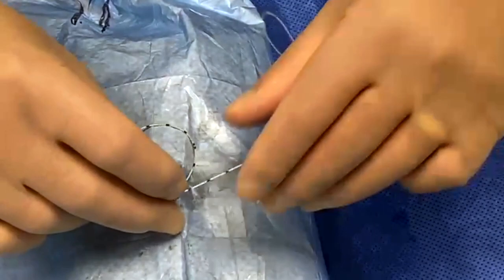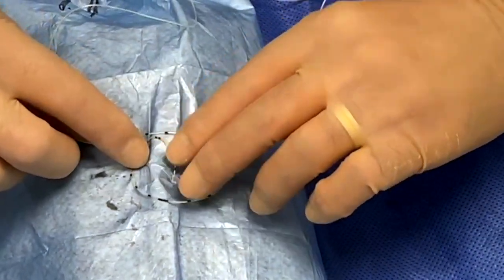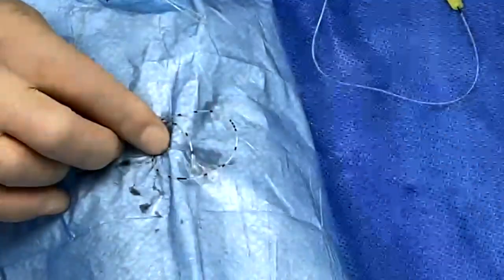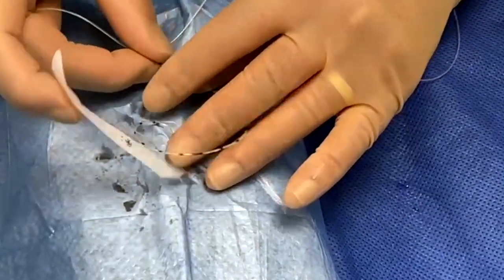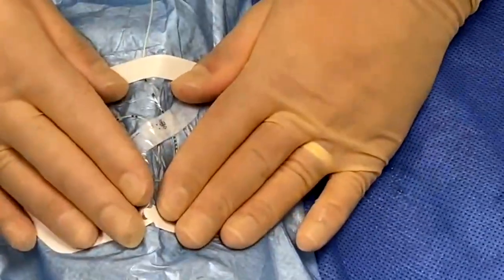The idea is to minimise the chance the catheter becomes dislodged. Create a coil like this with the catheter. Then ideally place some sterile strips across that coil to hold it in place. Once done, place a tegaderm directly on top. I'm going to mimic that with the cover from a tegaderm — take the date strip just to demonstrate. The dermabond applied to the skin also helps adhere the catheter. Place the strip across that, maintaining the view of the catheter insertion site, then place the tegaderm on top so it's nice and secure. You can then use additional tegaderm to secure it further up the leg or thigh.